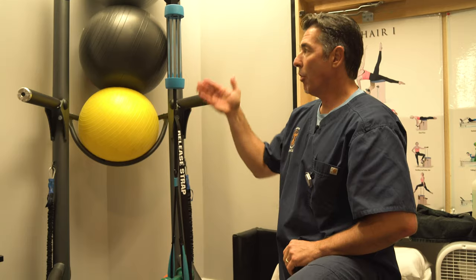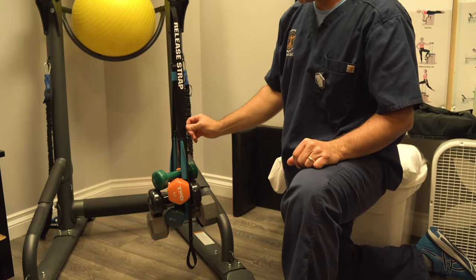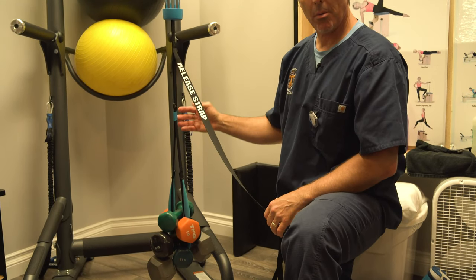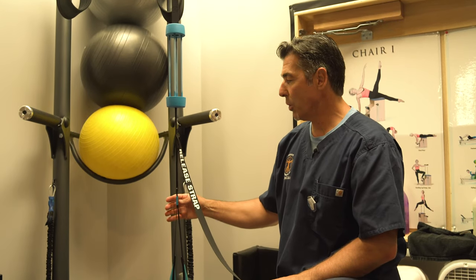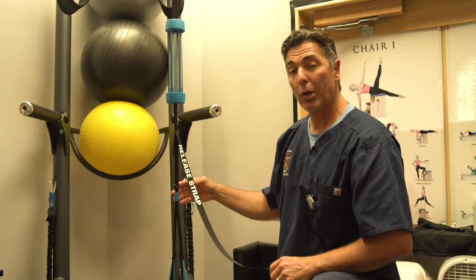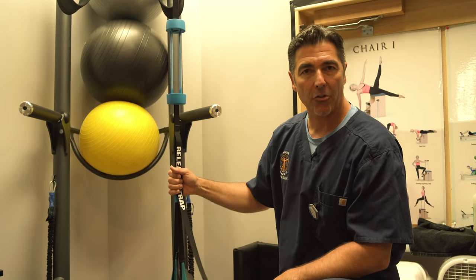50 pounds is about the maximum the human neck can handle, and that's right at the maximum capacity that Fisher Traction can handle. Anything above this, those bungees will break for safety purposes. With Fisher Traction, you're going to get the maximum amount of pull we can handle as humans, accomplish decompression, get real true therapeutic value — way more pull than anything else out there.